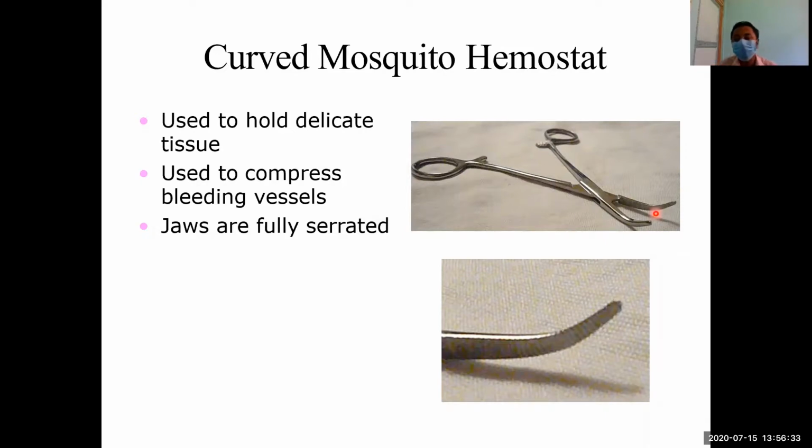Generally, whenever you pick up a forceps, you need to differentiate whether it is a Spencer-Wells or Kelly's. Spencer-Wells is fully serrated. Kelly's is not fully serrated. We cannot say it is half serrated either, but it is not serrated all throughout the length. Other types, like Edson's, you may be given, but it is okay if you do not specifically identify it as Edson's.